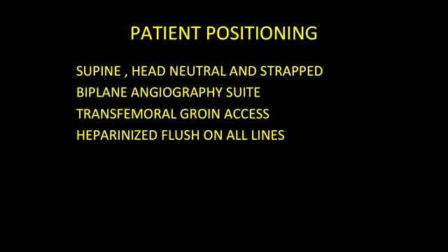We have a Siemens Artis Zee system in which we do our procedures in a hybrid room. There's a transfemoral groin access, and we use a heparinized flush on all the lines that are used for the procedure, which is a fairly standard setup for neurointerventional procedures done at many other centers.